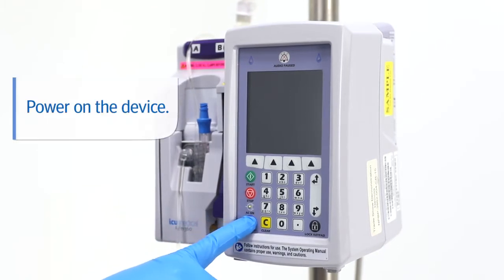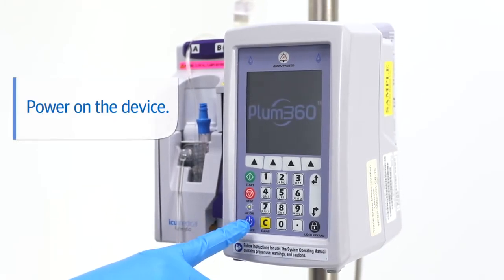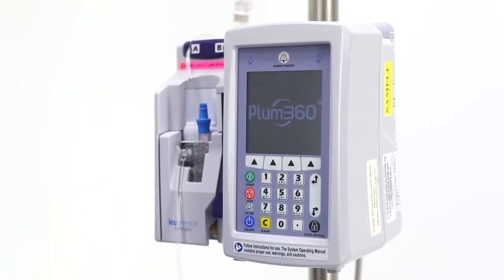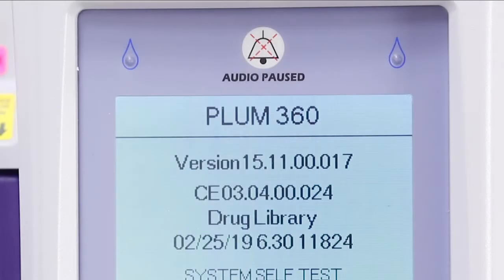First, power on the Plum 360 by pressing and holding the on-off hard key until you hear a beep. Line A and line B will blink.